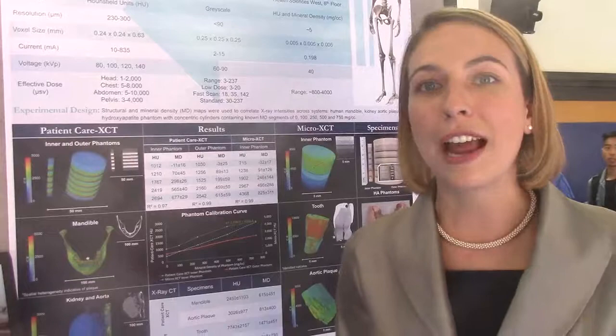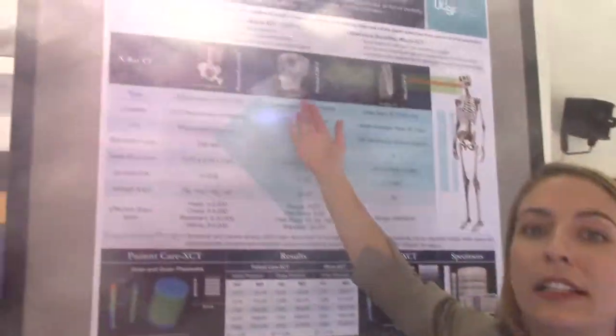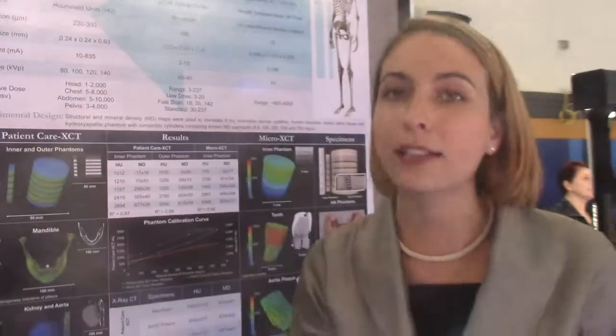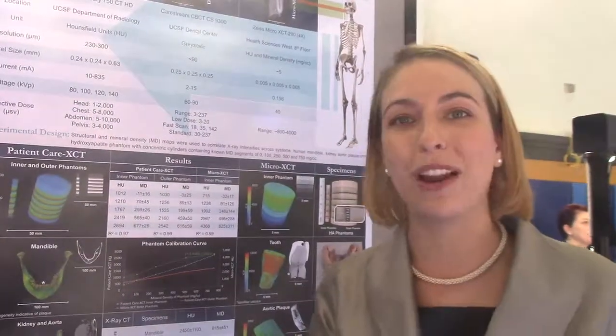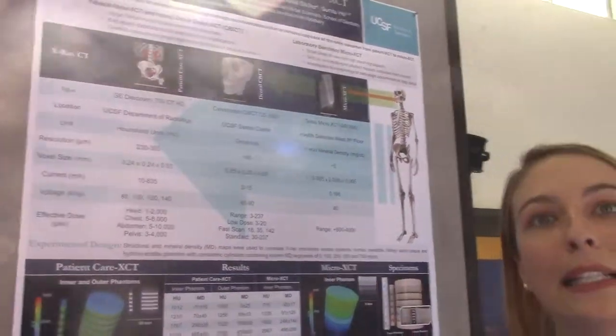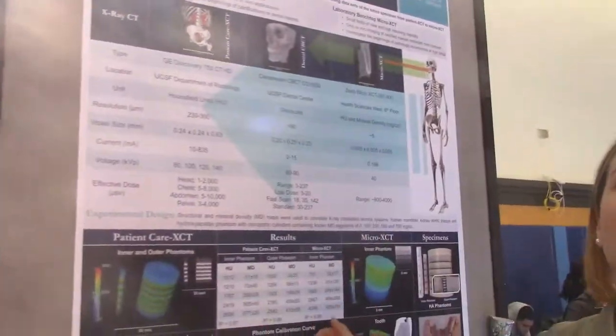So the next step I want to take is incorporating the dental cone beam CT technology. It took us a while to gain access to having this clinic wanting to work with us, but we're hoping that when we are able to incorporate the CBCT, we can convert grayscale to mineral density.